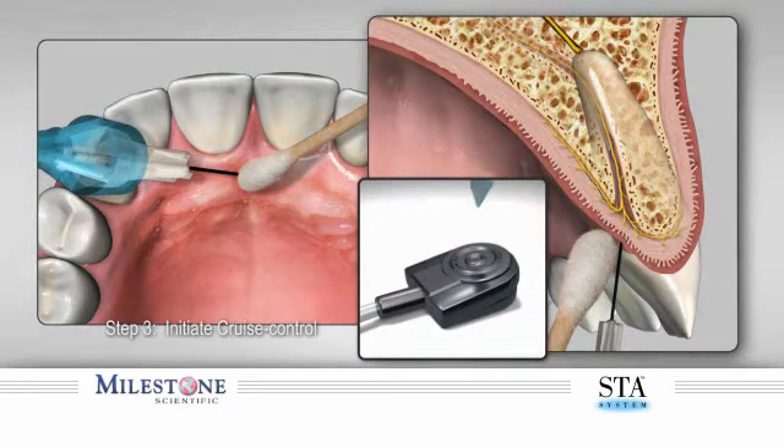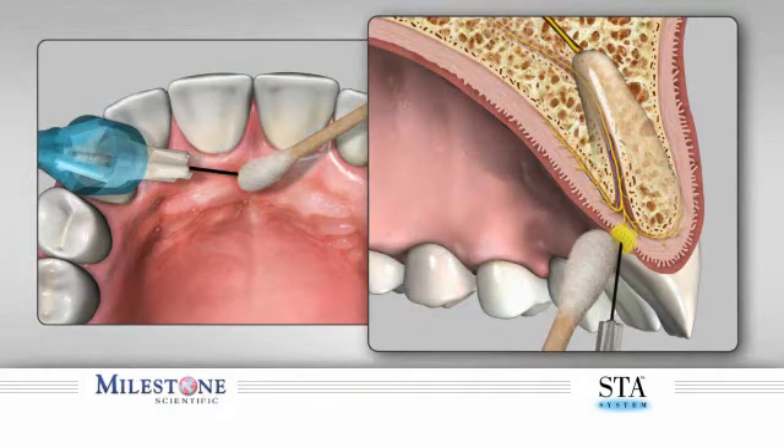Step 3: Initiate cruise control by depressing the foot pedal and counting three audible beeps. After the third beep, the STA system will announce the word "cruise." Upon hearing this announcement, remove your foot from the foot control pedal. The STA system will continue to beep, indicating anesthetic solution is continuing to flow. The technique of allowing anesthetic to contact and diffuse through the outer layers of tissues produces a topical anesthetic effect, numbing the surface. Do not allow the needle to puncture the tissue at this time. Continue to allow the needle to stay on the surface for another four beeps before initiating needle penetration.